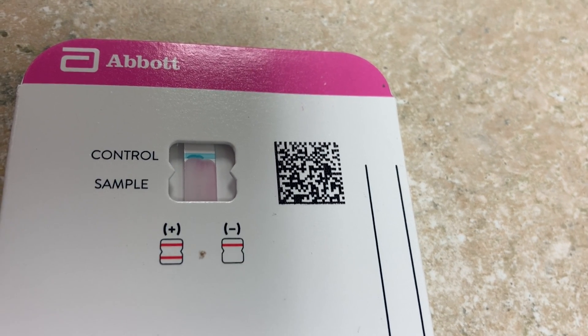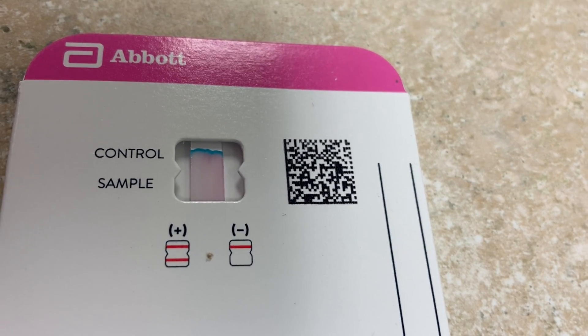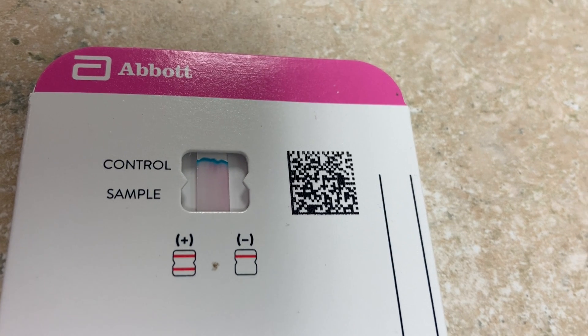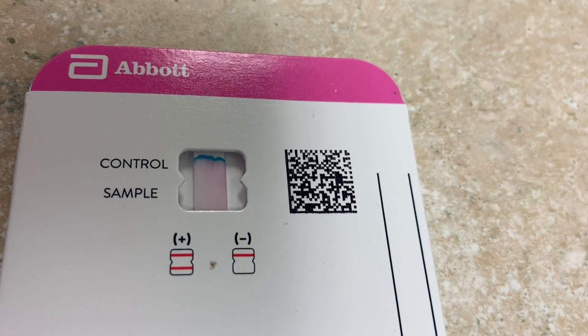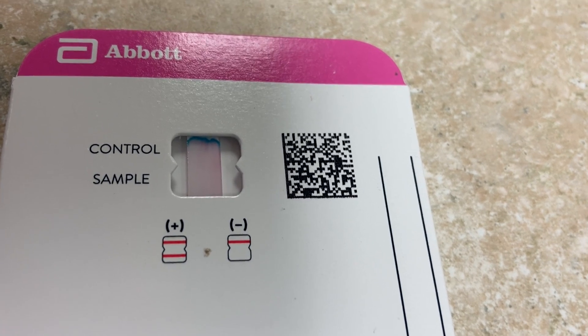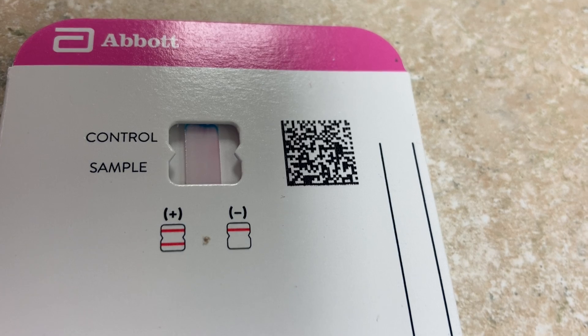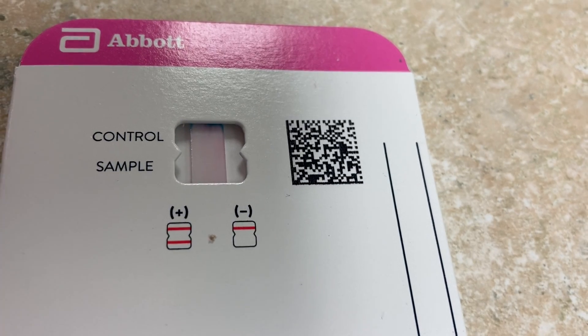After 15 minutes, if there are two lines it's positive. If there's just one line at the control — which starts blue and changes color — it's negative. If there's no line at all, the sample is not valid. I'll return with the results.